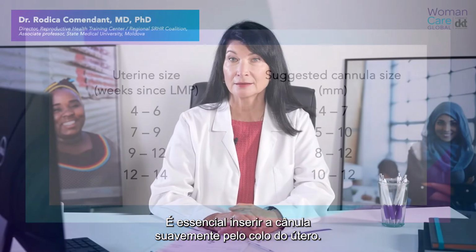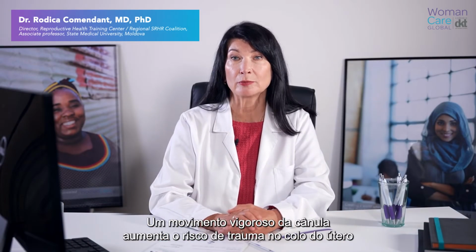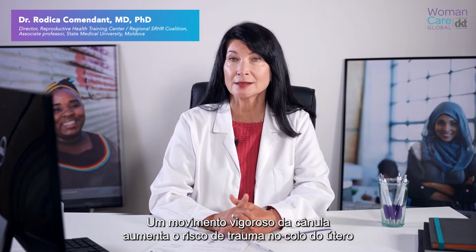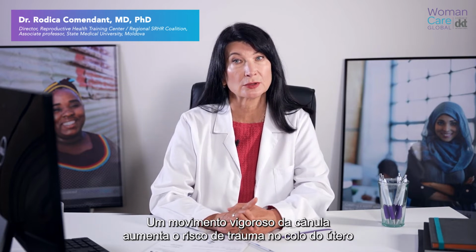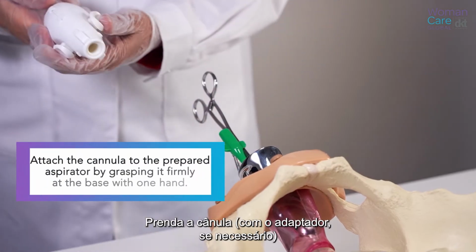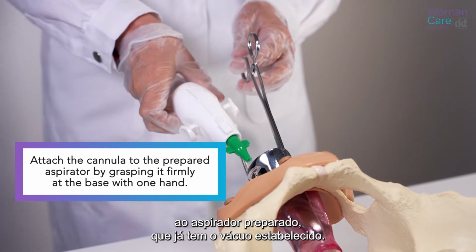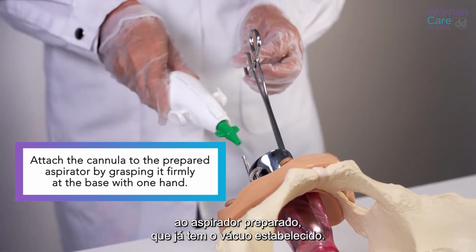It is critical to insert the cannula gently through the cervix. A forceful movement of the cannula increases the risk of trauma of the cervix and the uterus or the surrounding pelvic organs. Attach the cannula with the adapter, if required, to the prepared aspirator, which has the vacuum already established.